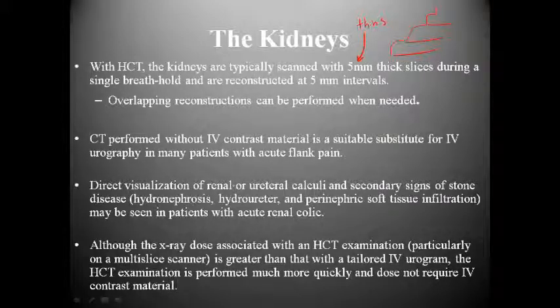This is a very important point here that we're putting a star by. CT performed without IV contrast material is a suitable substitute for IV urography in many patients with acute flank pain. And so gone are the days when ER physicians, for patients who would be coming in with lower back pain and having all the symptoms of some abnormality with kidneys, order IVPs. And so now we have actually changed to CT, just simply without contrast.